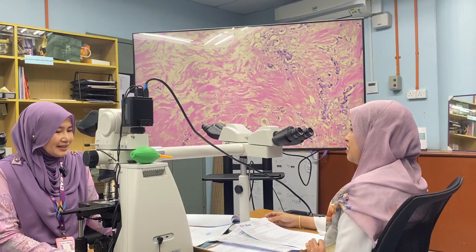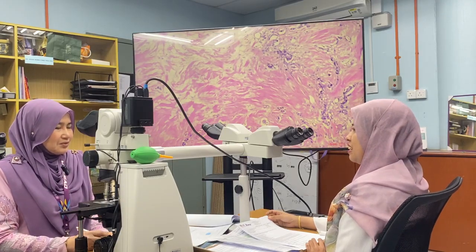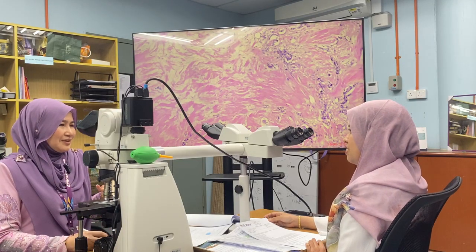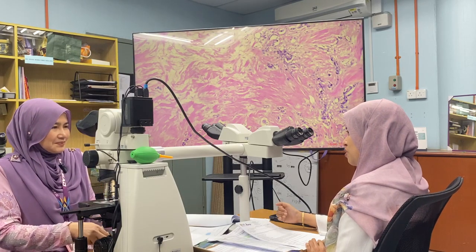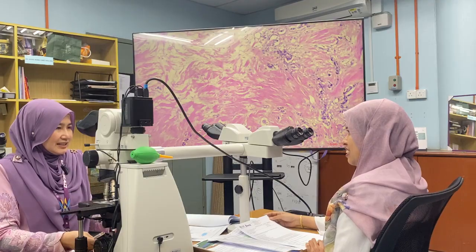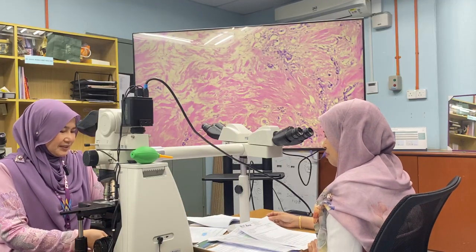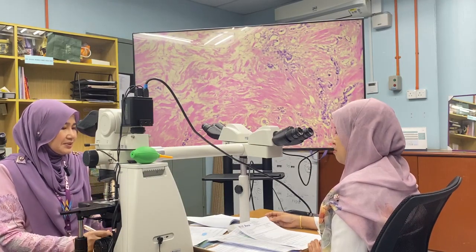KI67. So what about the KI67 in this case? In this case, it's low. I count about 1%. 1% KI67. So what is the significance of the percentage of KI67? How many percent do we take to consider for positive? Luminal A and B, luminal A is less than 14. Luminal B is more than 14. You said 14, it's not 20. Based on my reading it is 14, but I will clarify back with you after this. All right. Okay. Maybe we can take 20%. But of course, in this case, it's negative. So it's luminal A with a low risk. All right.